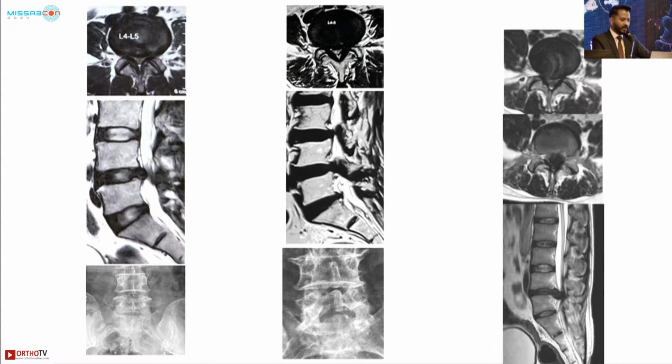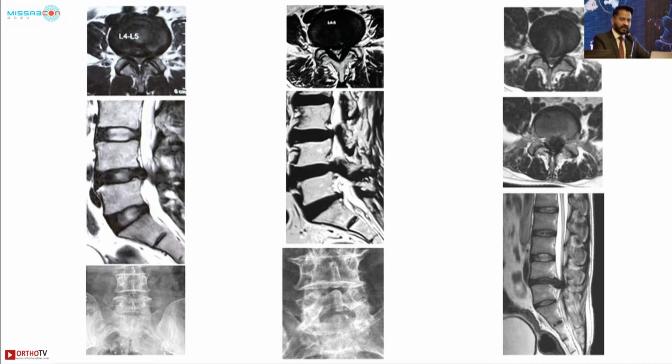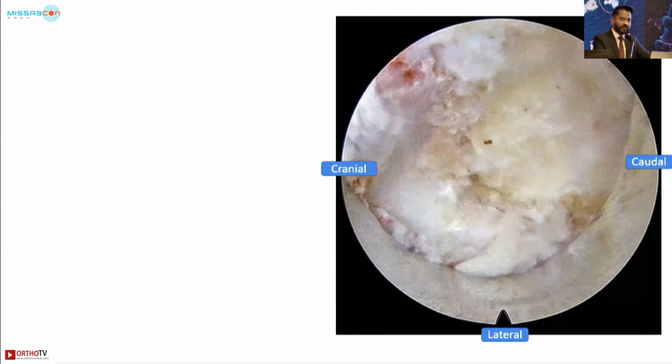surgery. So if you look at all these three preoperative cases, all these three MRIs have different pathology, but the plan will be the same going on the contralateral as well as the ipsilateral side. So now once you went inside, once you remove the soft tissue from the interlaminar window, now it's time to decide and time to locate the landmarks.